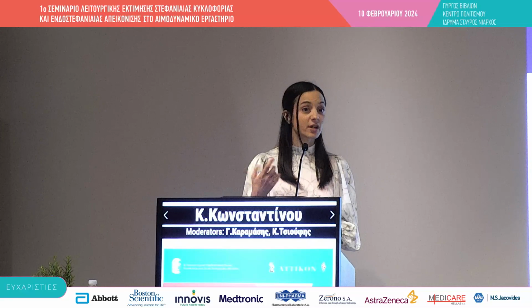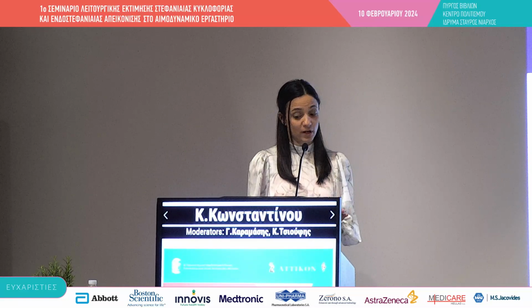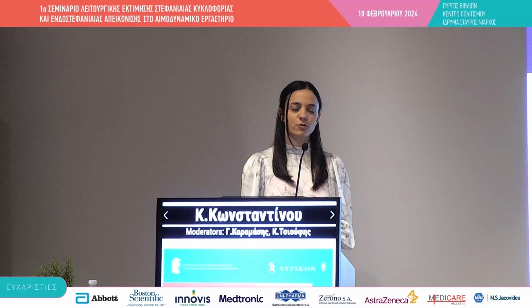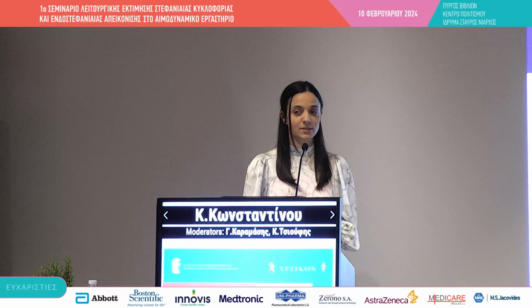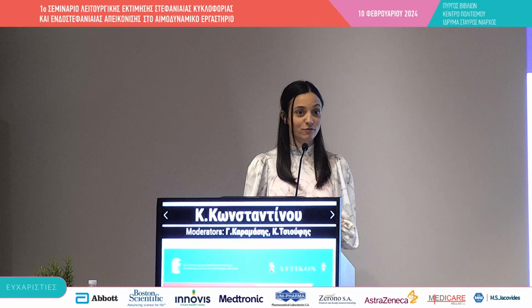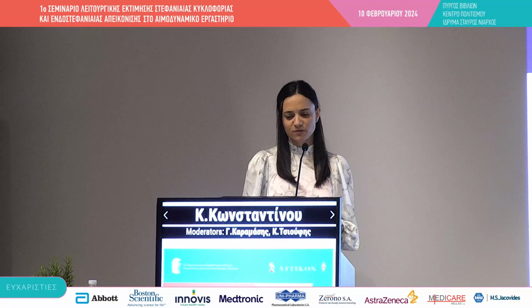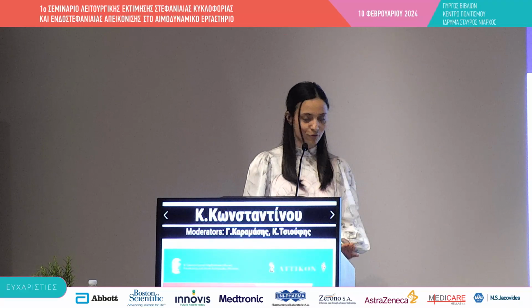Even with very severe spasm angiographically, people seem to tolerate that well, and it all resolves after administration of intracoronary nitrate. I used to initially keep a safety wire down the artery just in case it closes off and we can't get access to it. But the most recent cases we've done without a safety wire down, and nothing's gone wrong yet.